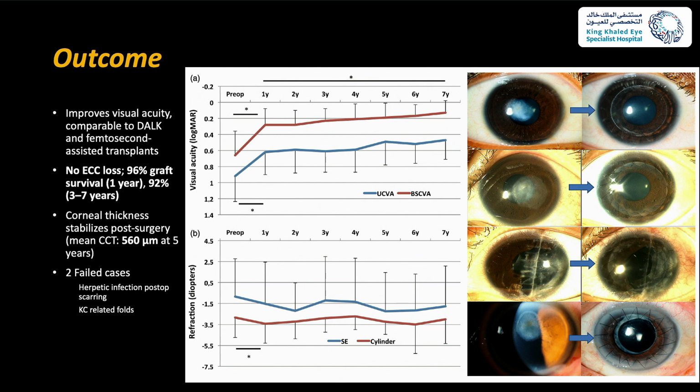Those are different HALK cases from the HALK paper, different cases, different pathologies where HALK was used to tackle the corneal scar issue. There were 2 failed cases, one related to herpetic infection post-op and one related to keratoconus fold, and we'll come to the fold.